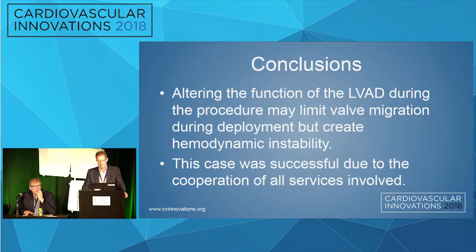Sometimes you can go for the carotid hangs off of there. A lot of these heart failure people have big vessels, and it's not a real threat, and so you don't have to worry about that energy loss in the arch. It's just hanging on a stick. Yeah. That'll make it a little easier. And that's actually what we did.